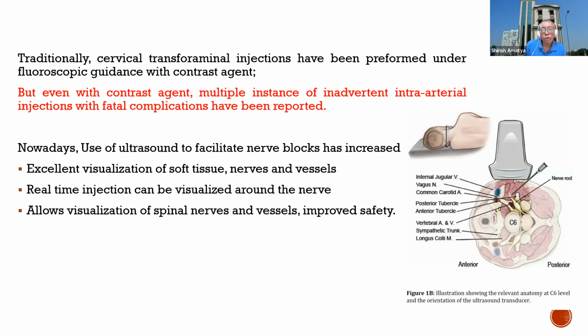And we can also use real-time injection. As we inject, we can see the spread of drug around the nerve, and it also allows visualization of various nerves and vessels, and it has greatly improved the safety, especially when injecting in this nerve area.